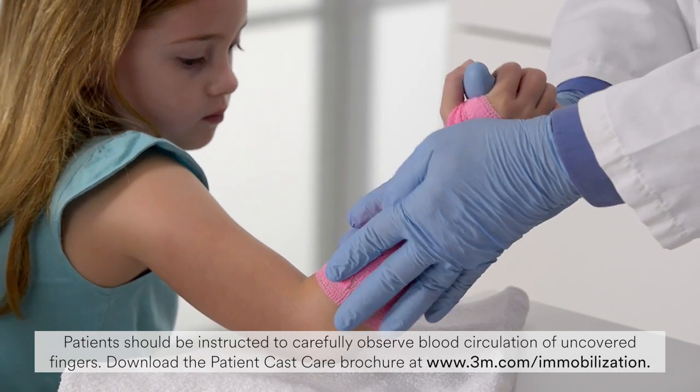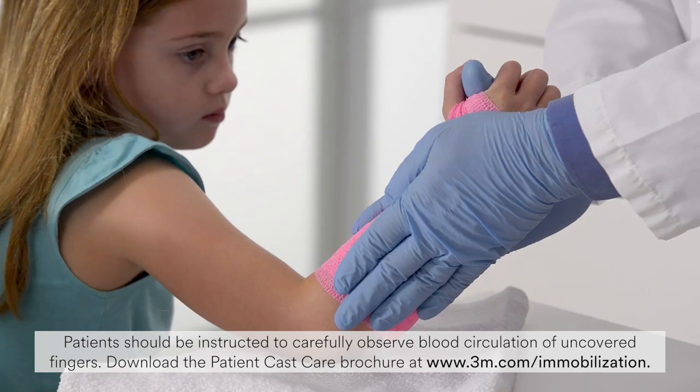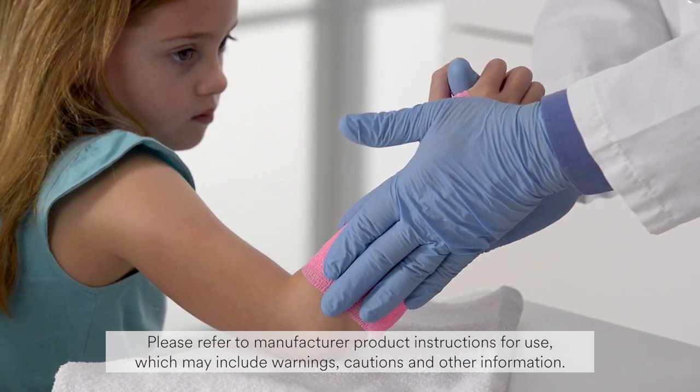Keep the arm still for 3 to 4 minutes to ensure the splint sets. The splint will be fully cured within 20 minutes.